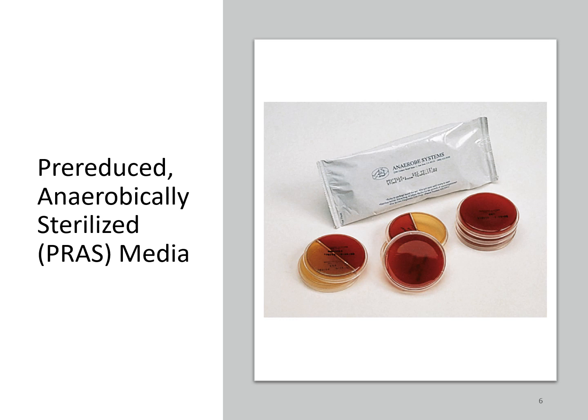There are some commercial systems available for anaerobic culture media, and something like this would be where you actually get the culture plates pre-packaged. So they're actually produced, packaged, and shipped and stored under anaerobic conditions. They're sealed in those little pouches to keep that agar plate in an anaerobic environment. And then once you're ready to set up that culture, you would take those plates out of that packaging, set it up, and then return it back to an anaerobic environment.